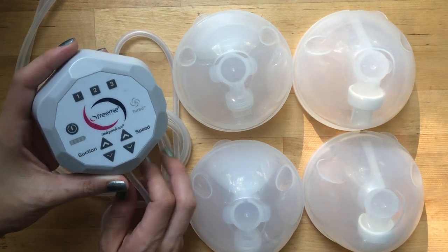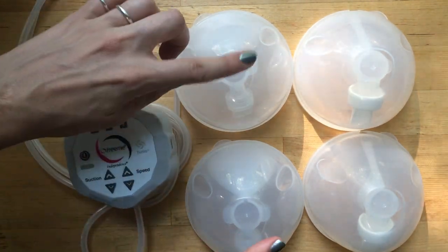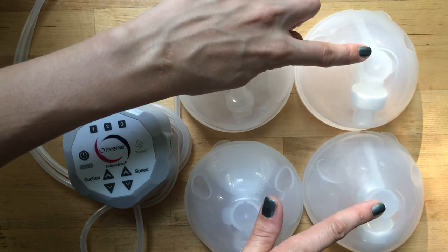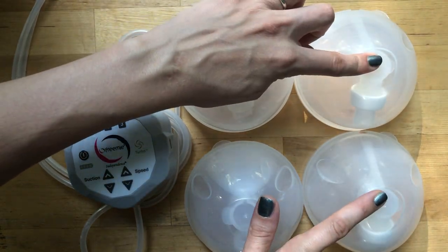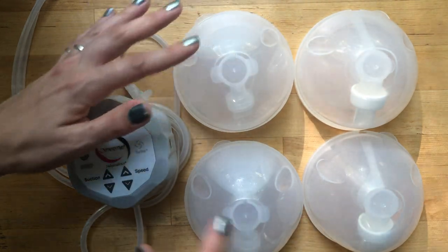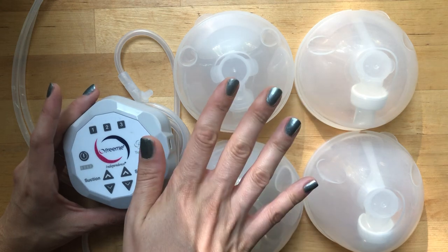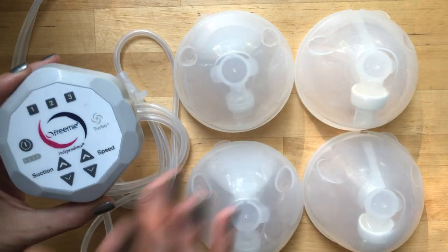Here we have the Freemie pump as well as the Freemie cups. You'll notice I have two pairs of cups - this is actually the older version and these are the newer ones that came with this pump. I will go over the differences between these two, but I want to start with the actual pump itself.